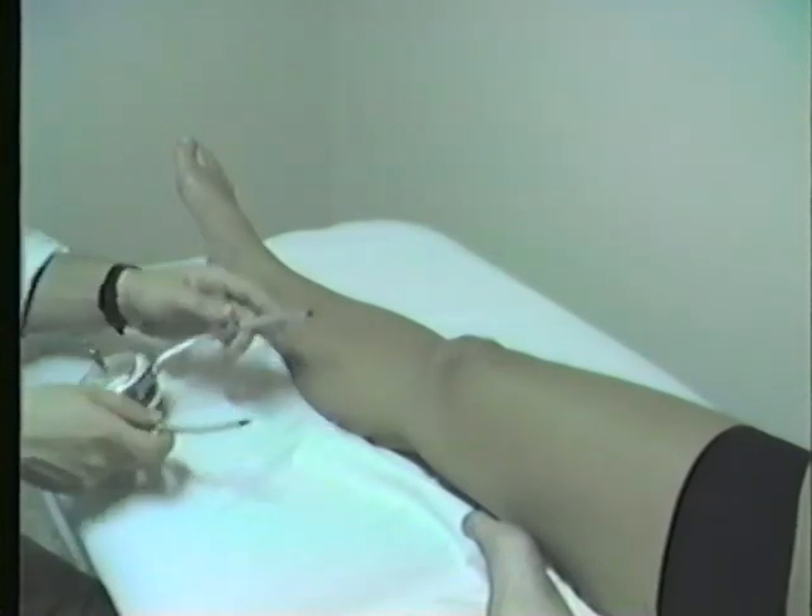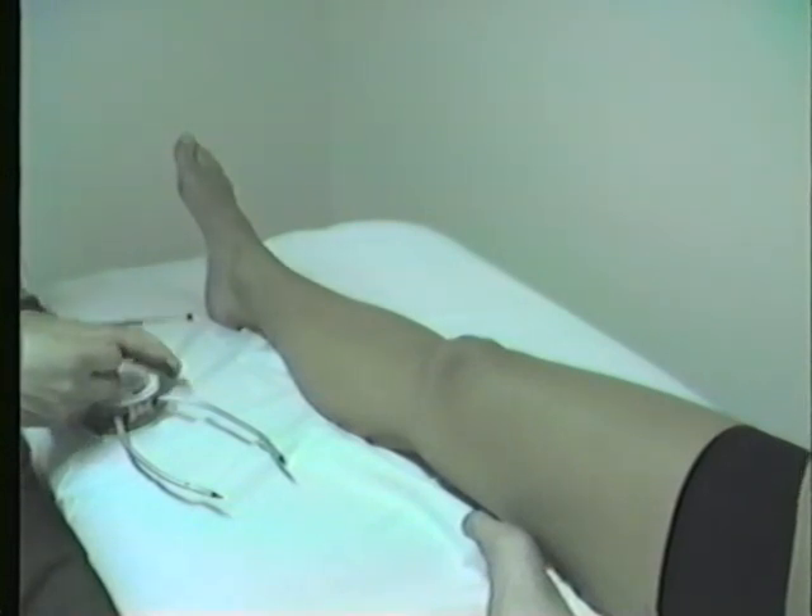So you can see that the DIAM has a lot of possibilities of application. You can measure cervical range of motion, pelvic alignment, range of motion, bone length, malleolar torsion — and you might think of some applications that I have not thought of. A scoliometer, for example. Okay, that's all.